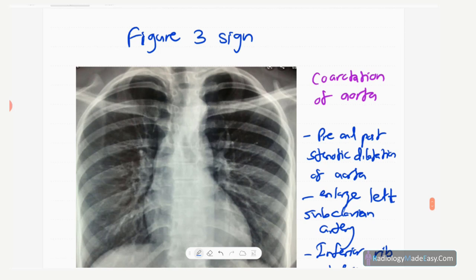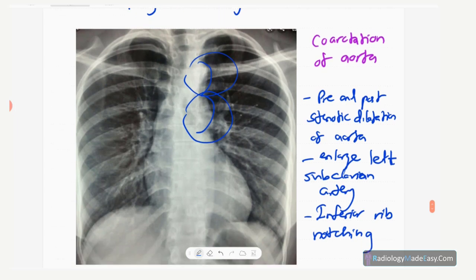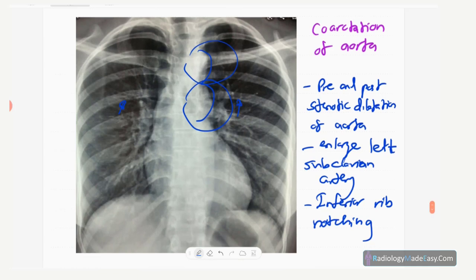Next is the figure-3 sign, seen in coarctation of the aorta. The upper part of the figure-3 is due to pre-stenotic dilatation and the lower part due to post-stenotic dilatation of the aorta. There may also be a dilated left subclavian artery. Rib notching is seen in the inferior aspect of the ribs due to collateral circulation.